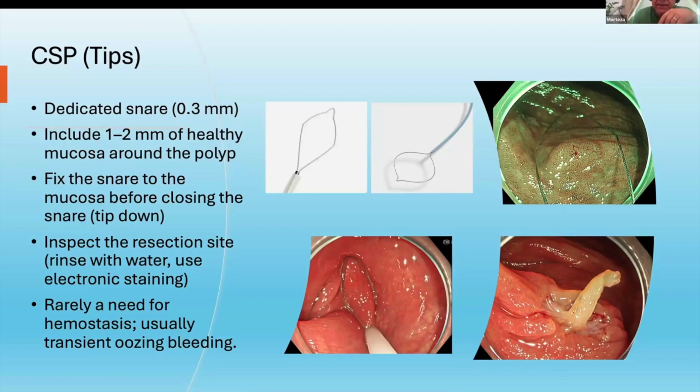Once you push it toward the lesion and you want to close it, the tip of the snare is not shaped to stay without moving, and this forward part of the snare is tipping up. Then I miss the lesion. You know what I mean? Yes, yes.